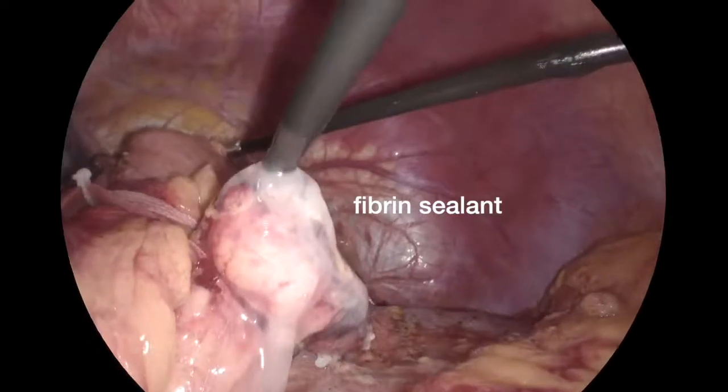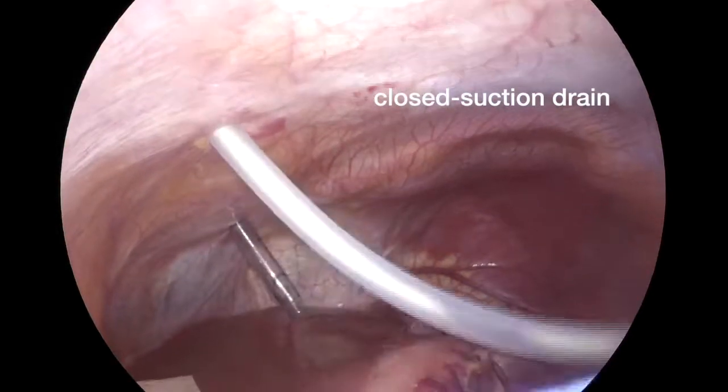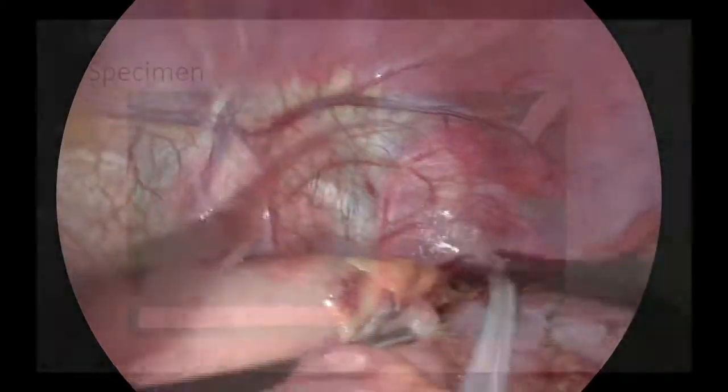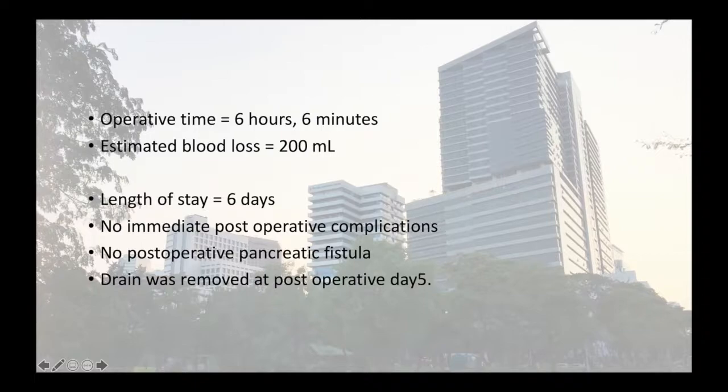Applying fibrin sealant on the proximal pancreatic stump. A closed suction drain was placed for detection of hemorrhage. Then the abdominal wall was closed and the skin was sutured. The operation took 6 hours and 6 minutes.